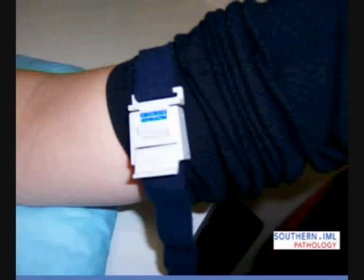The reason for this is that the clothing acts as an additional tourniquet, and when we release our tourniquet at the end of the venipuncture, the restrictive clothing is still stopping the normal blood flow in the arm. This will cause a build-up of blood, leading to bruising or hematoma.